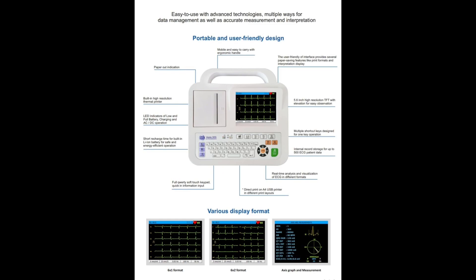Moreover in this video, we will see how to take the print through the inbuilt printer and transfer the PDF data to a pen drive, including a 12 channel printout.